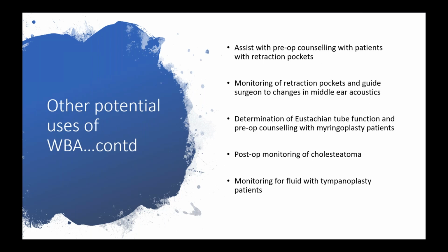We can help with monitoring of retraction pockets and guide the surgeons when there are changes in the middle ear, because as I said, a retraction pocket can be a precursor for cholesteatoma. So when we monitor a person over time, they don't have to go through a CT, and we can have a series of wideband absorbance measures and then guide the surgeons. That is another possible future application, and a very interesting one.